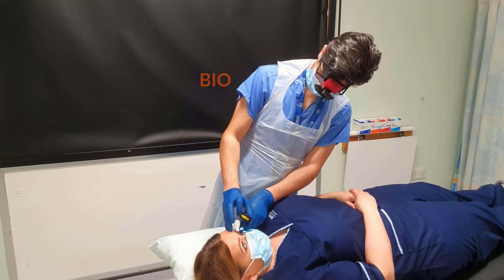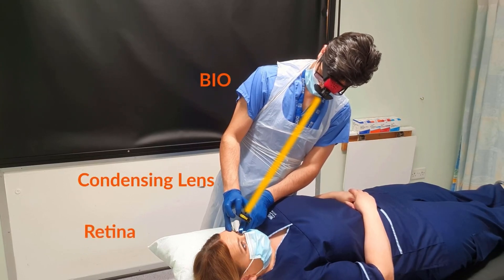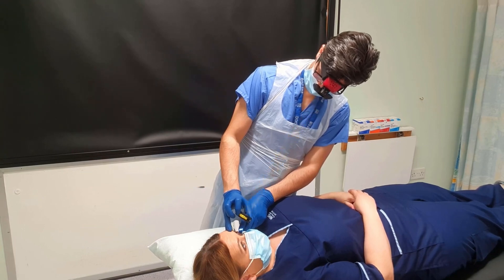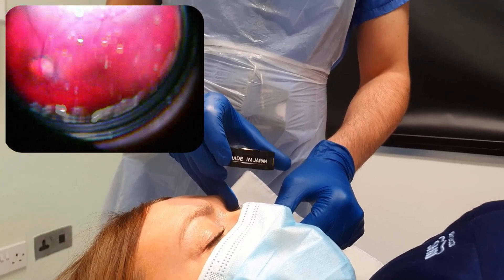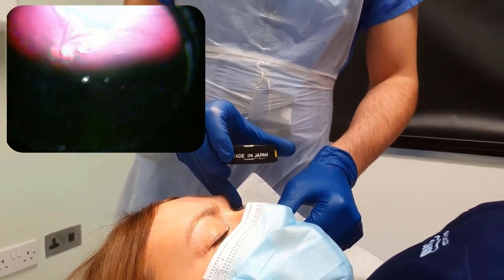It's important to have the BIO, condensing lens, and the area of retina to be examined all aligned. If you see shadows on the edge of your view, it may mean that one of these is incorrectly aligned. To avoid unwanted glare, you can try tilting the lens as this may help to eliminate this. Bring the posterior pole into view and examine the optic disc and the macula. Adjust the brightness according to the quality of view and patient comfort. On initial examination, the light will be very bright for the patient and this will settle once the retina is bleached in all four quadrants.